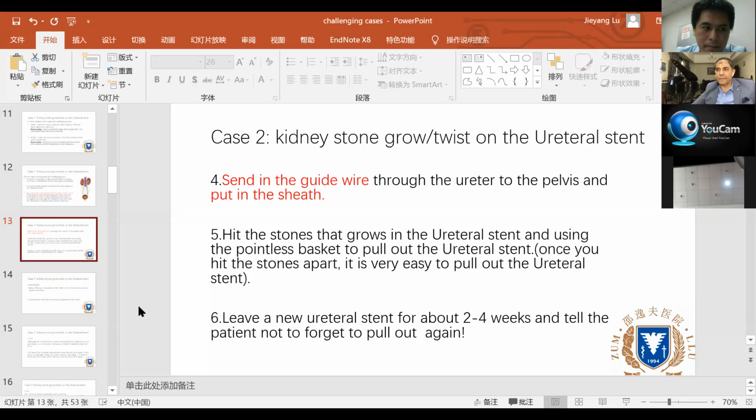A stent may be left in the pelvis just to drain it and enhance healing of the pelvic wall opening. I cannot imagine that he makes a window between the pelvis and the cyst, and he ends up leaving the DJ stent in the cyst. Dr. Lou, can you explain your experience in that?